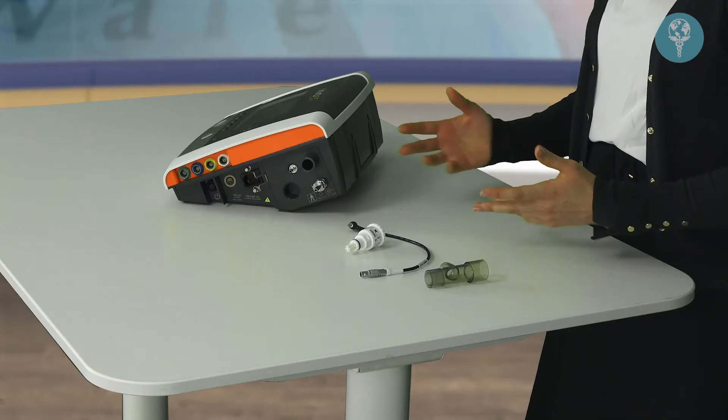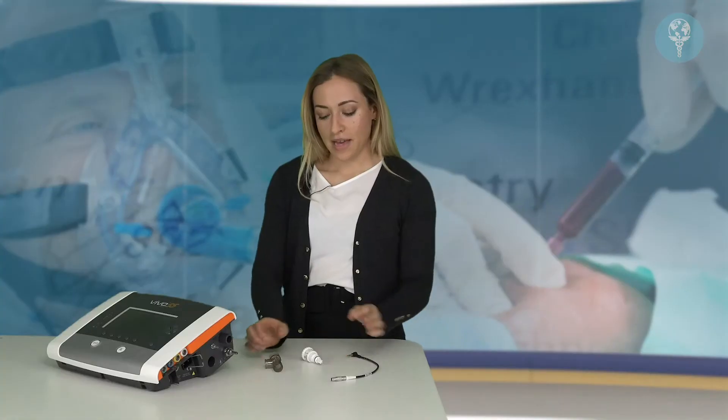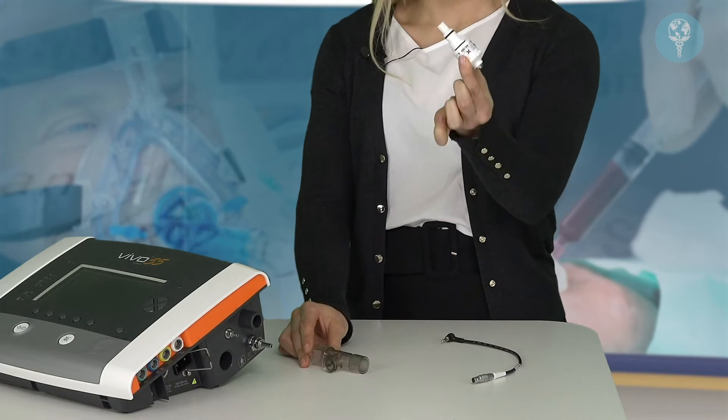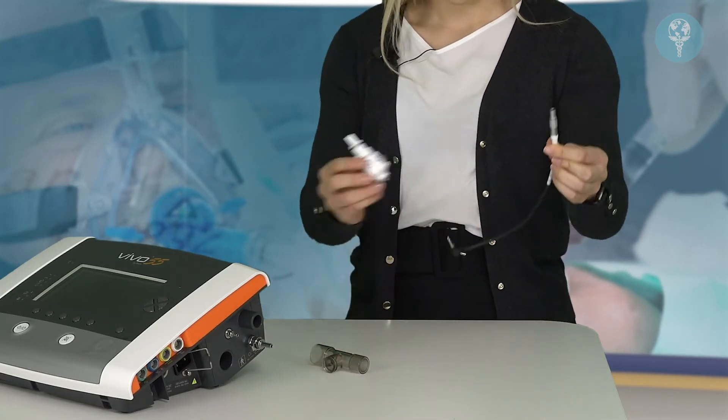In this video we're going to cover the setup of the FiO2 sensor. The FiO2 sensor allows you to measure the fraction of inspired oxygen that you're delivering to the patient when you're entraining the oxygen through the device. The FiO2 sensor comes in three parts: the T-piece adapter, the oxygen sensor itself, and the cable to connect all three.